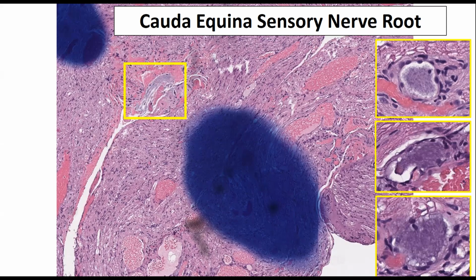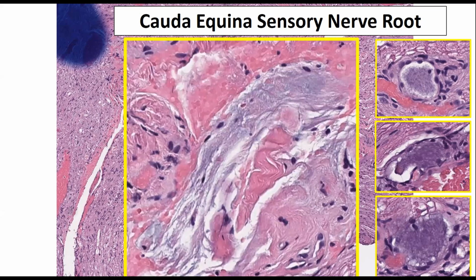Now, that little bit of myxoid material was not enough to call a myxopapillary ependymoma. The reason is, with pathologic processes in virtually all tissues, there can be myxoid degeneration as a common stromal change. We had to prove it. How do I prove it? Well, the easiest way is deep stepped sections. This is showing a high power, strongly suspicious. Honestly, I probably could have called it based on this, but why not be sure?